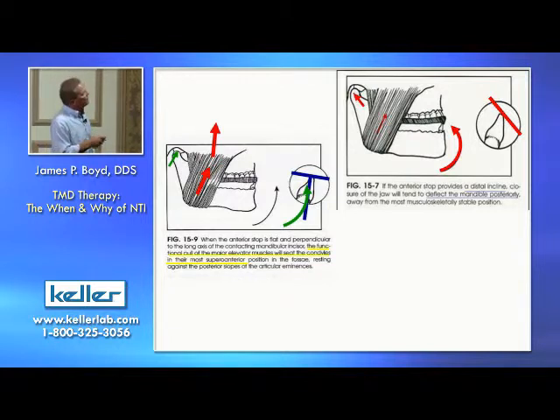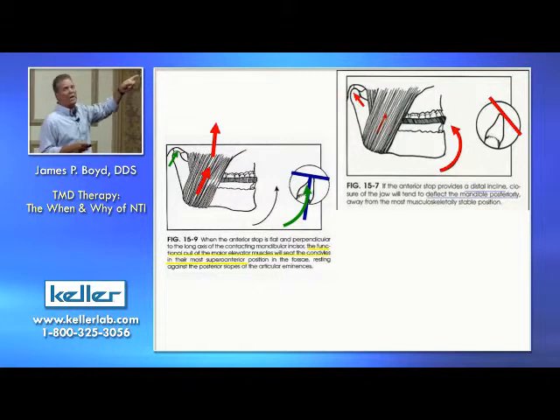Now, if you're making this in the chair and this thing is angled, the patient bites down, they go, that's weird, and they'll pull their jaw backwards. As they bite and squeeze, they go, hurts. Oh no, I'm distalizing the condyle. Well, they're responding to the strain of their incisor.